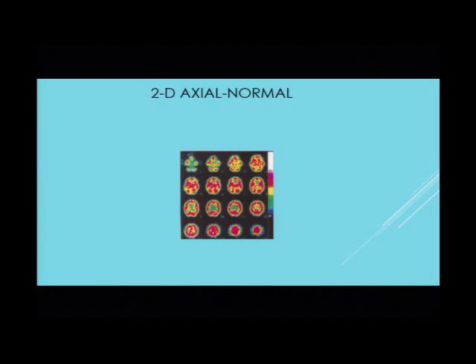So here we go with the examples of the normal. I'll call your attention to the flow scale here, which is what I just taught you. You see that the hot colors are at the top, and the dark colors at the bottom. And these are slices from the bottom of the brain going up to the top. If you just look at it in a global way, everything looks red. There's a little bit of white there, deeper in the brain. And everything looks kind of symmetric and convex and kind of thick, so keep that image in your head. Those are slices from the bottom.